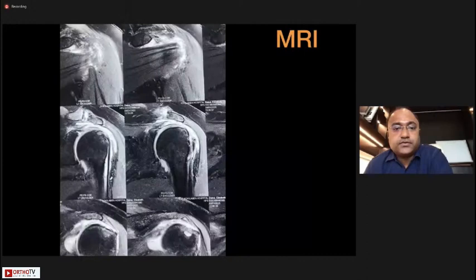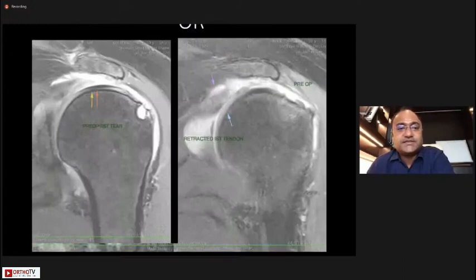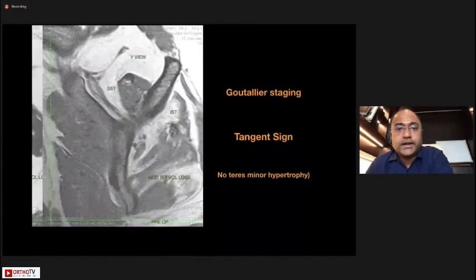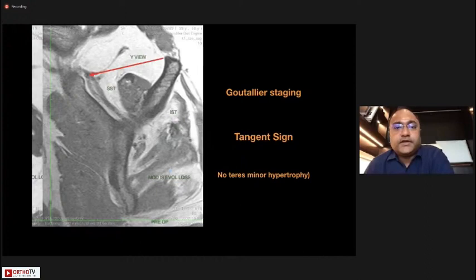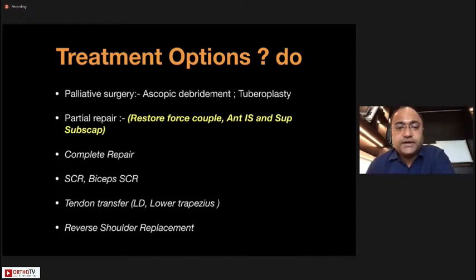This is the MRI of our patient with pseudoparalysis. Her subscapularis was intact and she had a massive retracted supraspinatus tear — the tendon is gone all the way to the edge of the humeral head. The sagittal oblique view is very important for assessing fatty infiltration. The tangent sign shows the muscle belly is below it but with minimal fatty infiltration, so I decided to go ahead with a complete repair as I felt this was a repairable tear.